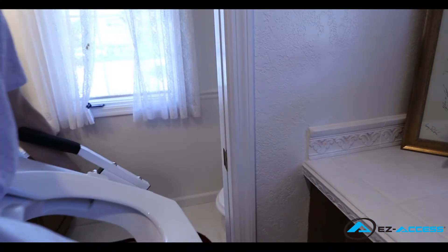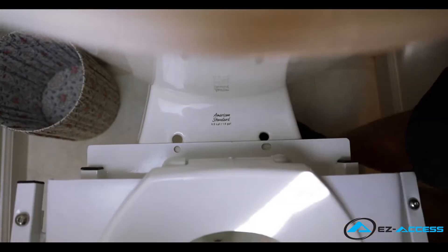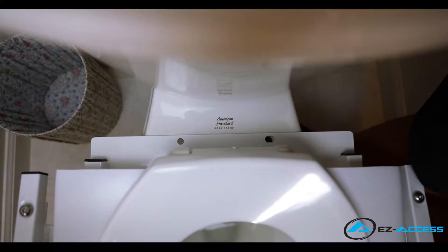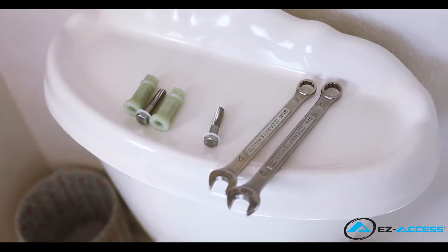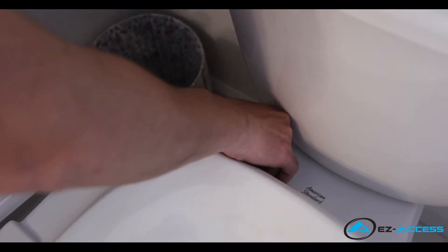Now bring in the tilt frame and set it in place on the toilet bowl. Align the two holes on the mounting plate with the existing two holes on the toilet bowl. The mounting plate front holes are for a standard toilet seat and the back holes are for an elongated seat. Using the hardware provided, place one bolt and washer through each hole in the tilt frame and into the hole on the toilet bowl.